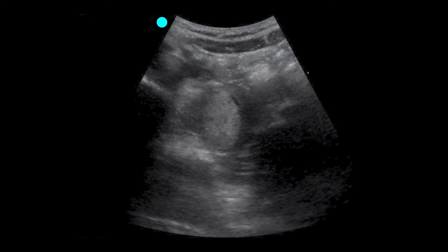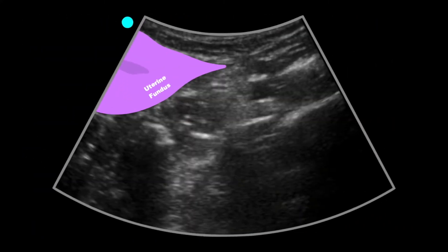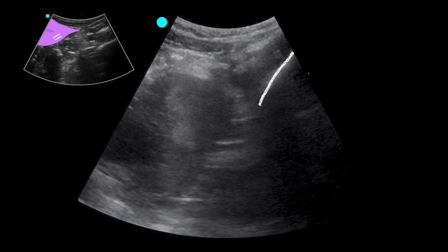After looking at the right adnexa we're going to look at the left. We want to see if there are any adjacent masses; we may or may not see the ovary in this transabdominal view, but we definitely want to make sure there are no pelvic masses. In this particular patient, likely because of what's going on on the right, the uterus itself is displaced towards the pelvic bone, so there's not a lot of room to see much of the left adnexa in this view. This means we have to perform a transvaginal ultrasound.